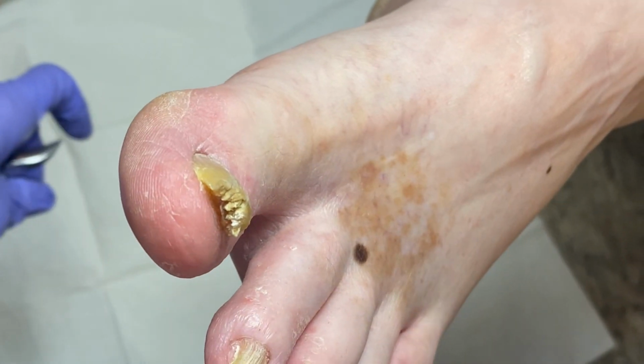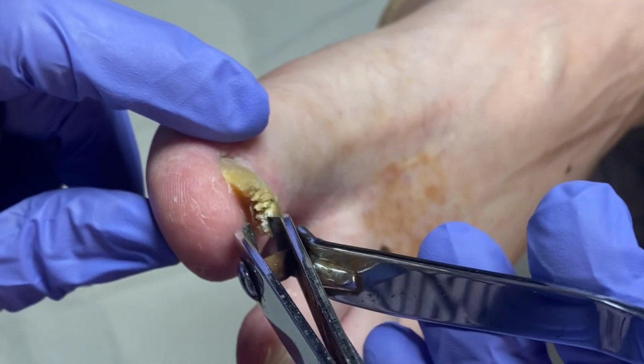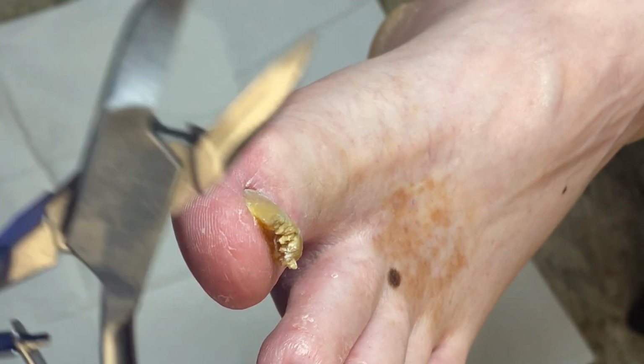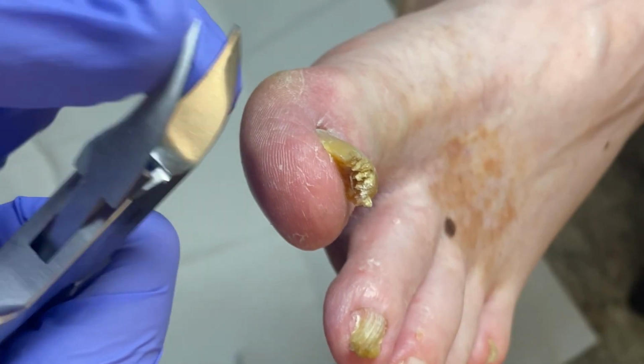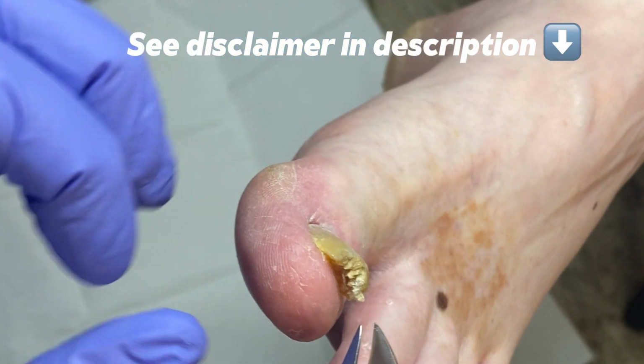Okay, so it's just about impossible to trim these nails with a nail clipper. Plus you can't see what you're doing. You could easily cut something. So you need to find a nipper like this, double action, a little bit curved here. The little tapered end helps to get these thick layers.